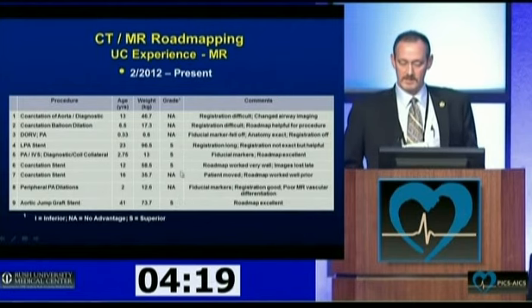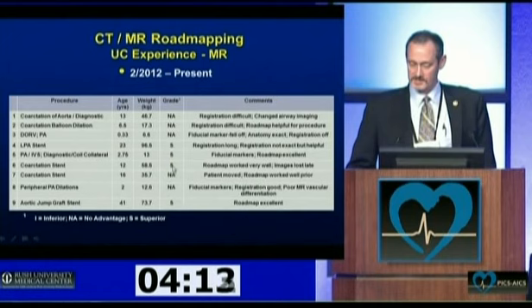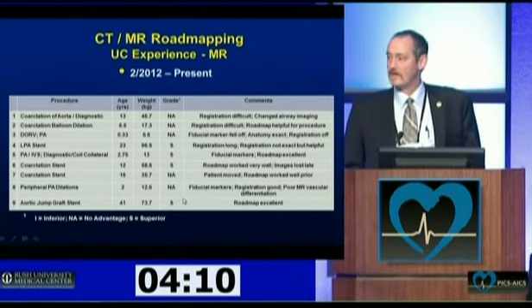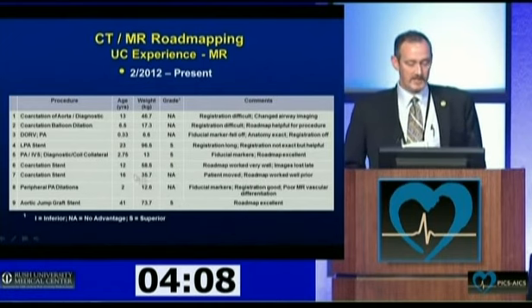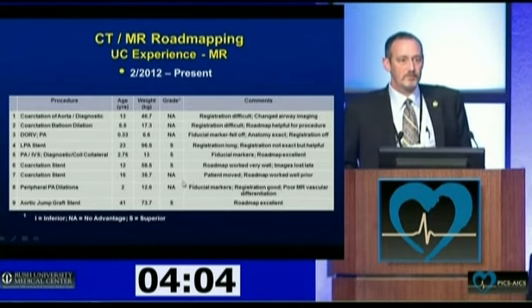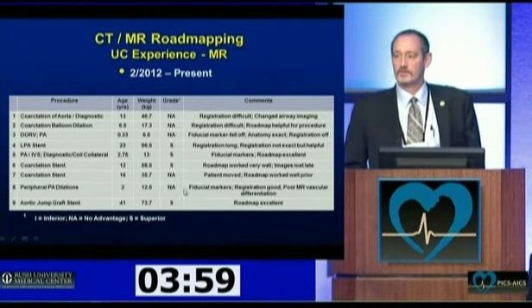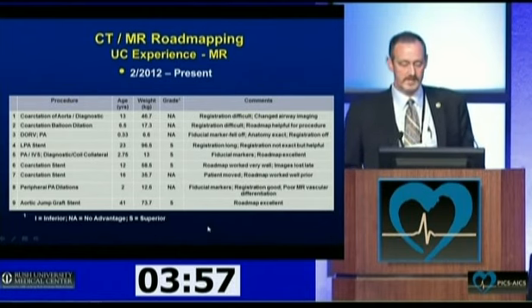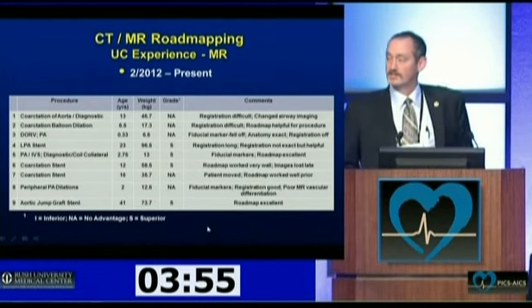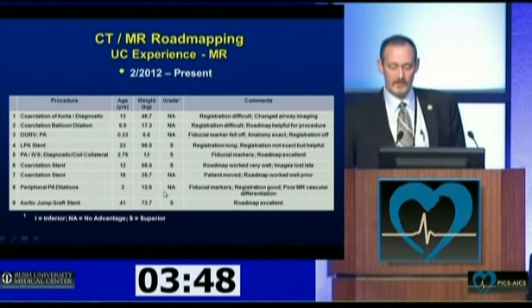As far as the technology goes, these 2 patients, a little later in our experience, actually have nothing to do with the technology. It has more to do with what happened during the procedure. This patient, on whom we were going to perform a coarctation stent, ended up coughing and moving on the table right as we were getting ready to deliver the stent. With the time involved, even though it wasn't much, we just decided to deliver the stent. But the utility of it, based on that situation, fell into the not superior category.